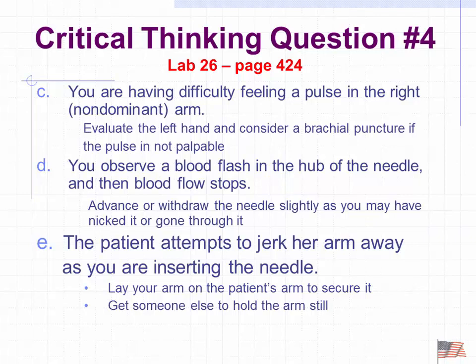Having difficulty feeling a pulse in the right non-dominant arm. If you can't feel a pulse, you probably shouldn't be doing a blind puncture. That's not indicated. Okay, so look to the other arms or look to a brachial.